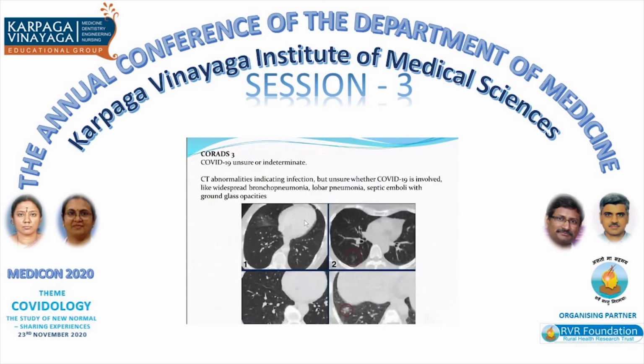Whereas this is CORADS 3. CORADS 3, you see here, there is a ground glass density here. So this is ground glass, but it is not peripheral, or it's not subpleural. This is along the fissure. Again, here there are some ground glass areas, or again here. Then again these areas. So these are not very classical of COVID, but this is indeterminate, and you should be careful to label it.